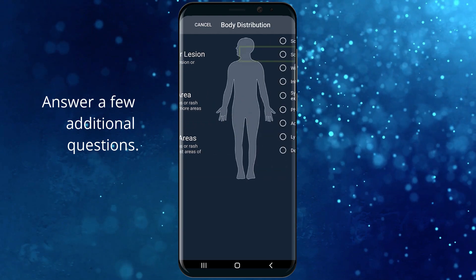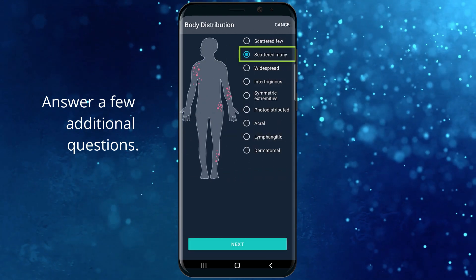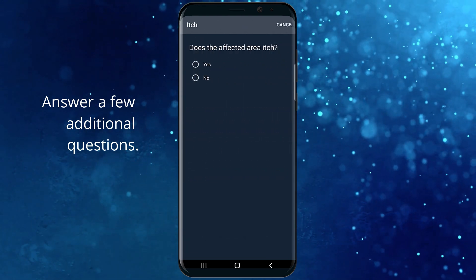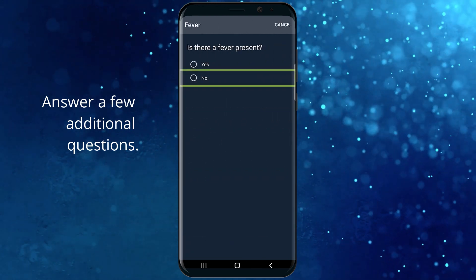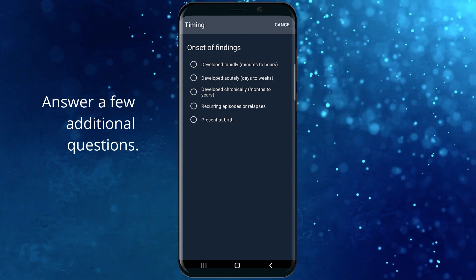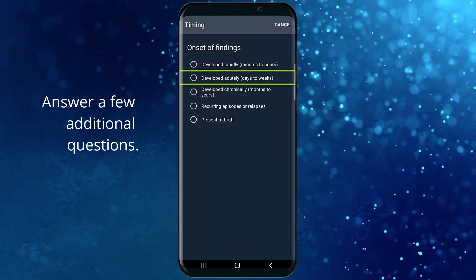Multiple areas. Scattered many. Yes, it's pruritic. No fever present. Developed acutely.